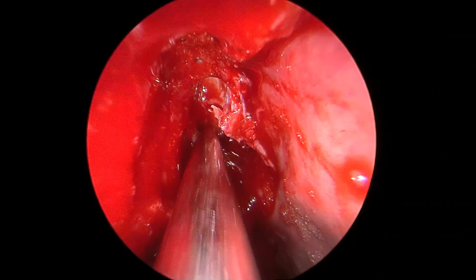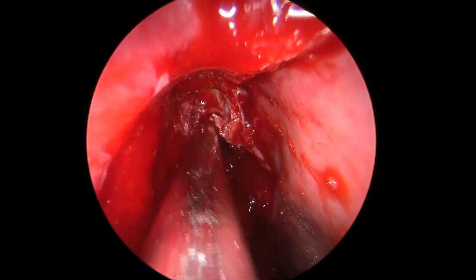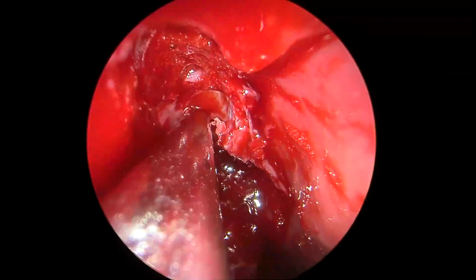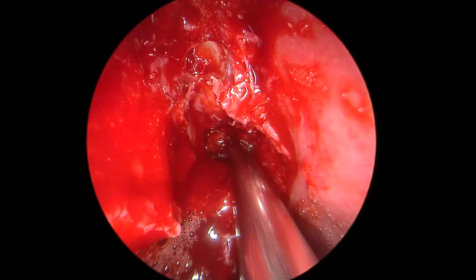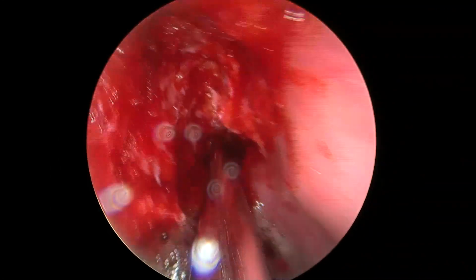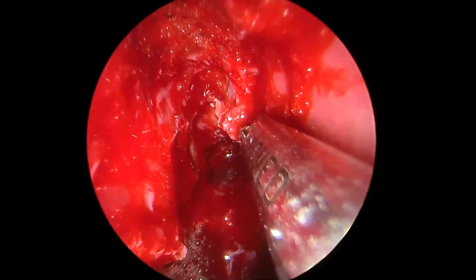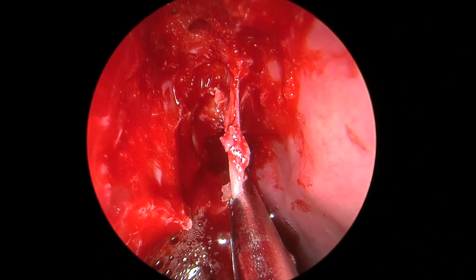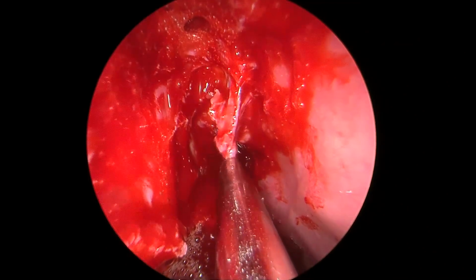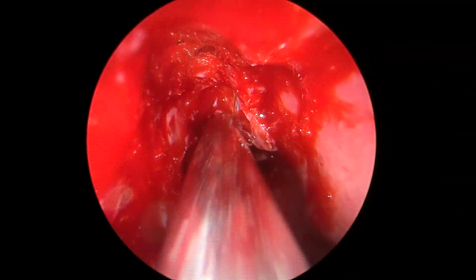Now, the starting part of surgery is not being shown here. One can see we have completed a broad ethmoidectomy, sphenoidotomy, and the resection of the middle turbinate. The resection of middle turbinate gives us wide access to the skull base, the cribriform plate, and also provides us a large amount of mucosa of the middle turbinate, which we can harvest as a final closing layer in these patients. Normally, we prefer a multi-layer closure in these patients.